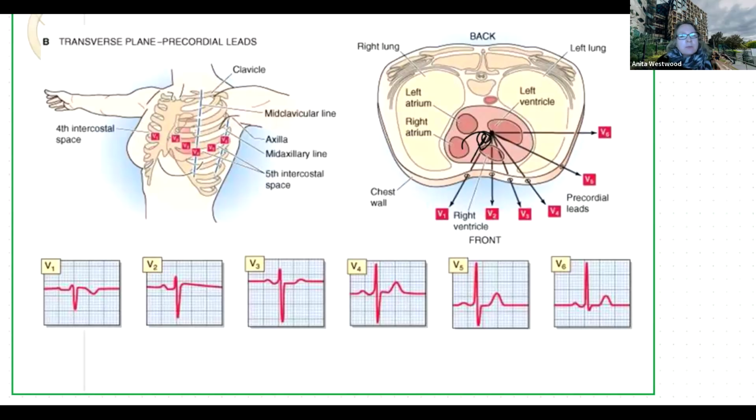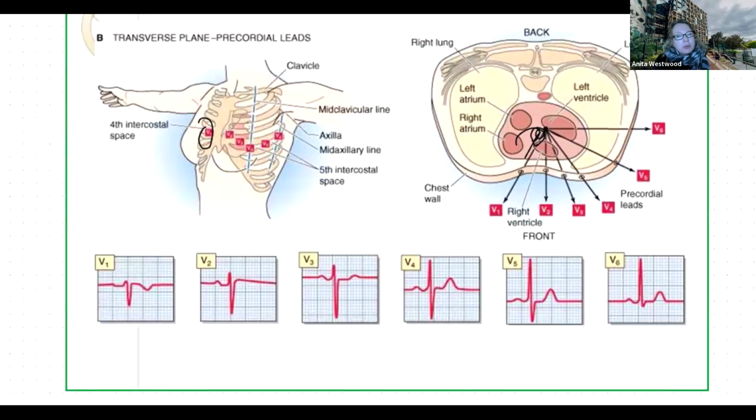That's got that window, it's looking directly at that aspect. Now, it doesn't have the conduction travelling directly towards it. We know it travels down towards the foot, towards limb lead 2, but it's still able to view the amplitude. It's still able to view that aspect as the electrical conduction passes through that part of the conduction pathway.